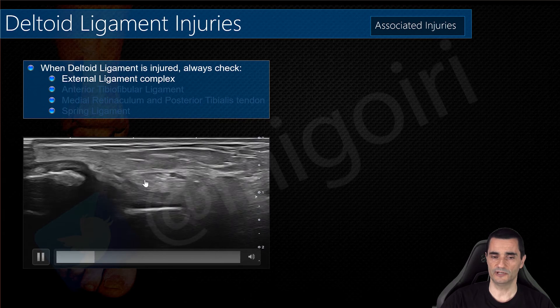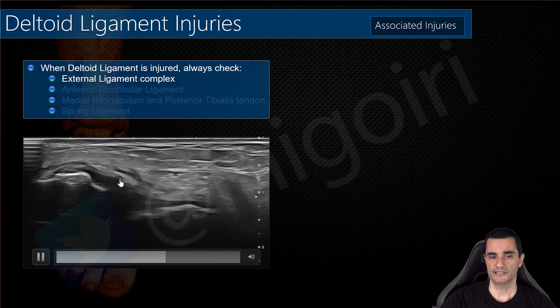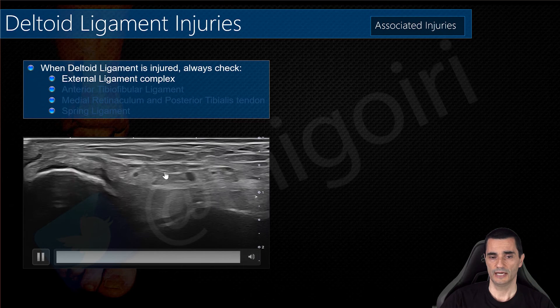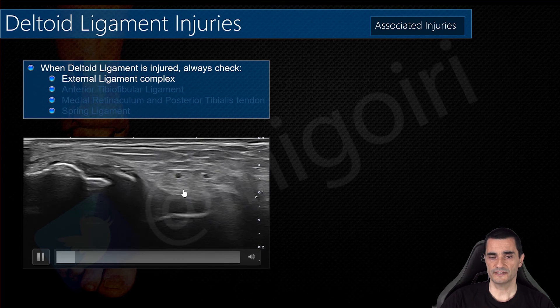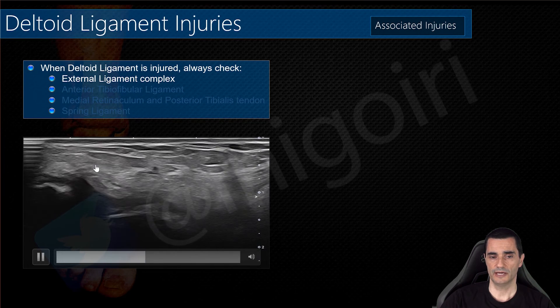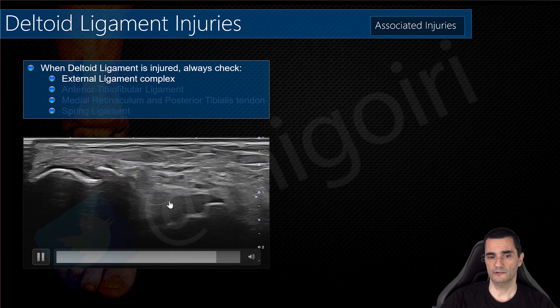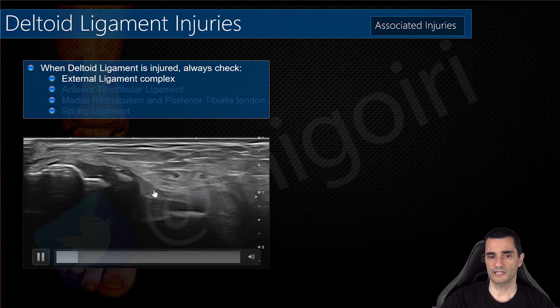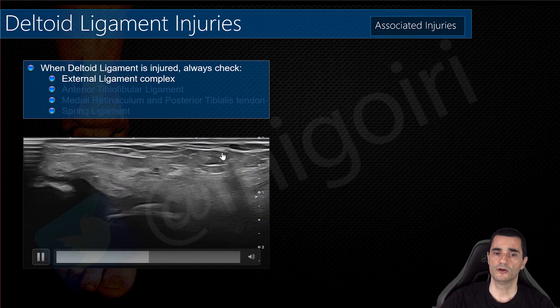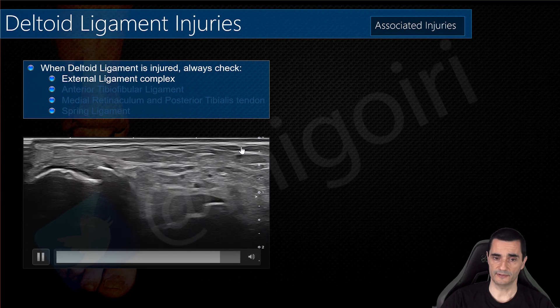This is the fibula — you can see the avulsion of the bone and the absence of the fascicle of the anterior talofibular ligament. There is no ligament here, so this is a grade 3 affection of the anterior talofibular ligament.